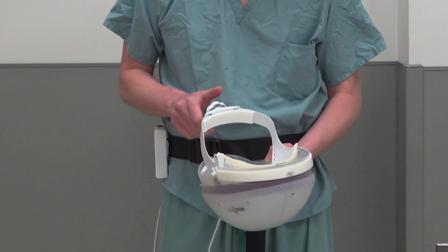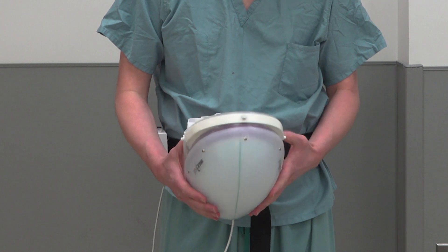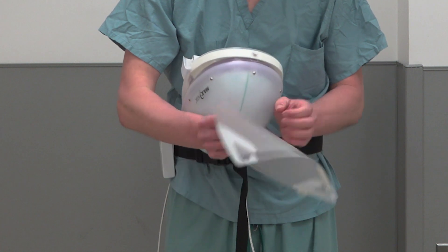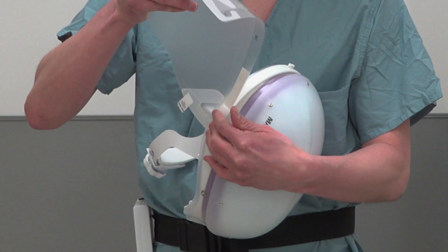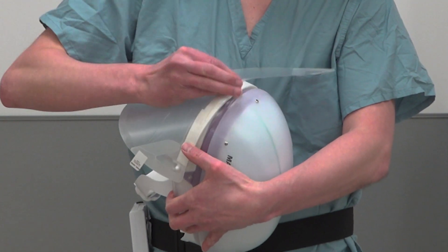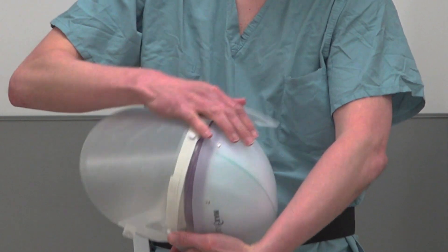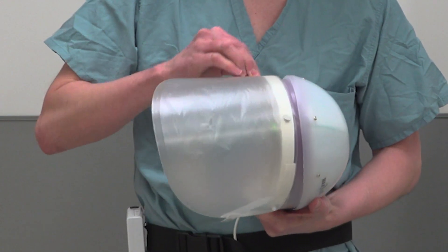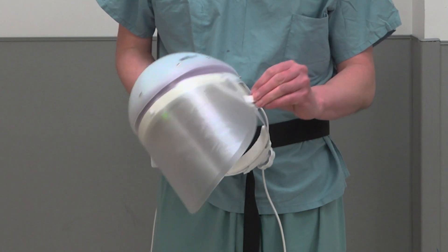Next, loosen the headband adjustment knob — this will ensure the head circumference is as large as possible. Next, attach the disposable lens cuff. Most people can use a medium to large size; a small to medium size is also available. Attach the lens cuff to the three mounting points on the helmet.